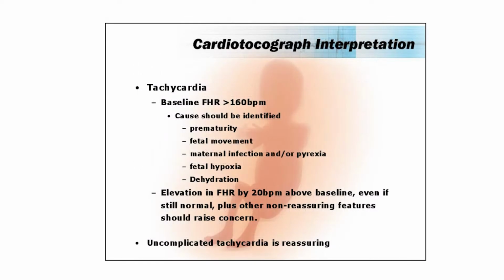So a couple of simple things that I'll go through a little bit more quickly. Tachycardia is an increase in the baseline above 160, isn't it? But also watch for baselines that are 20 beats above the admitting baseline. So if you have a mother that comes in and her baseline is 120, the fetal baseline is 120, and it rises to 140 or 145, we should be concerned. A rising fetal heart rate baseline is one of the first signs of fetal hypoxemia. Not hypoxia, but hypoxemia, a falling blood oxygen circulating level.